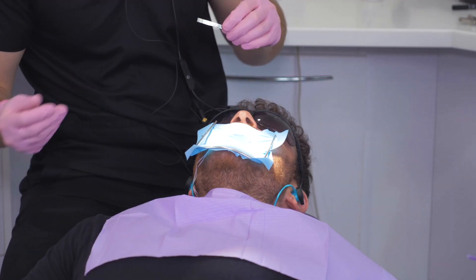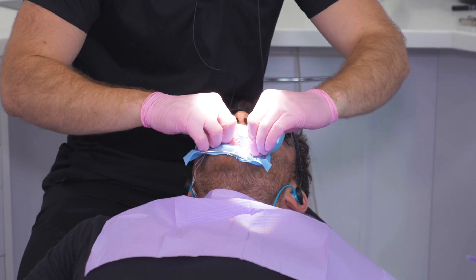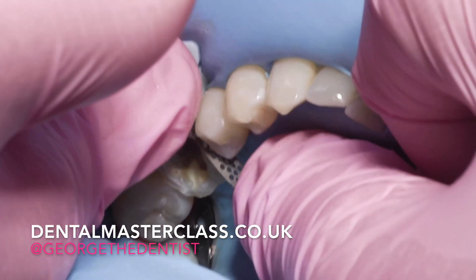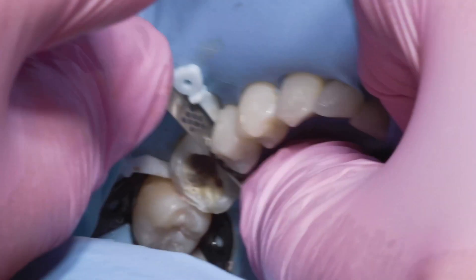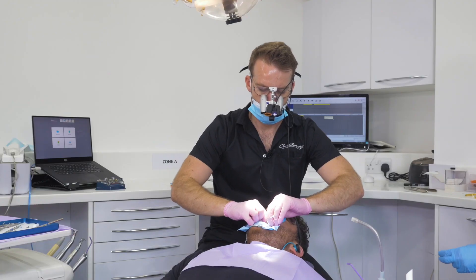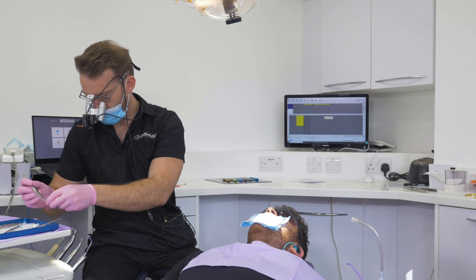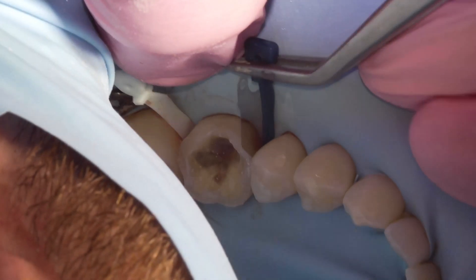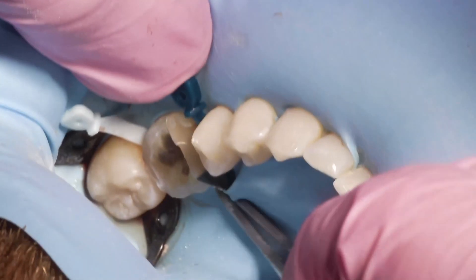In order to protect the adjacent tooth, what I sometimes do is after the pre-wedging I will use a serrated strip and a metal polishing strip just to open up that contact point a bit. Once that's opened up it's going to allow me to get these things in — a little wedge which is attached to a sheet of metal — to protect the interproximal areas.